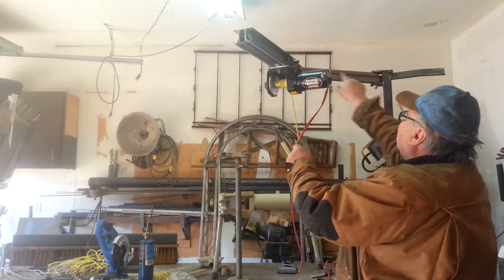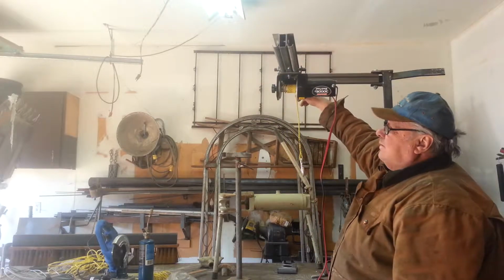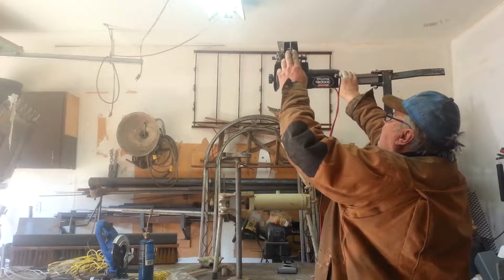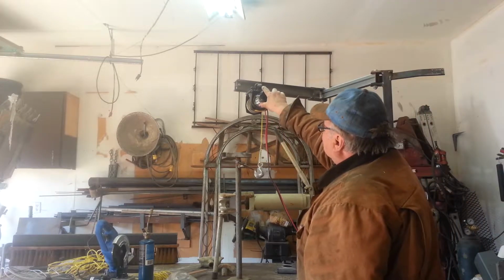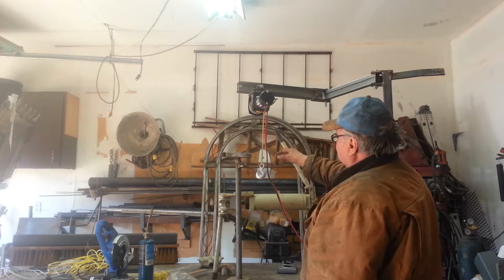The reason for my length here is this is exactly the center point of the opening of her sliding van door on the driver's side, and I have to keep the wheelchair in the middle. So as it's folding in, I can pivot that point to stay in the center. Once the wheelchair is most of the way in, she can swing it back right behind the seat, lower it down, and just leave this attached.